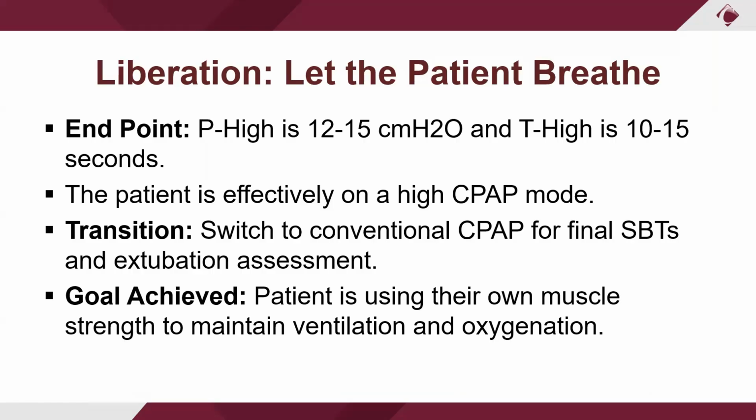Again, it's your assessment of looking at them and watching their mechanics and their breathing. You'll notice that once they're recruited and their compliance is good, it's not taking much volume. They're breathing barely any, 10, 12, 15 on a CPAP. It's nothing at all for them. And all the ventilators, depending on which ones you use, vary in how high the time high goes out. Some go out to 10, 15, some go to 20, some go to 30 seconds.